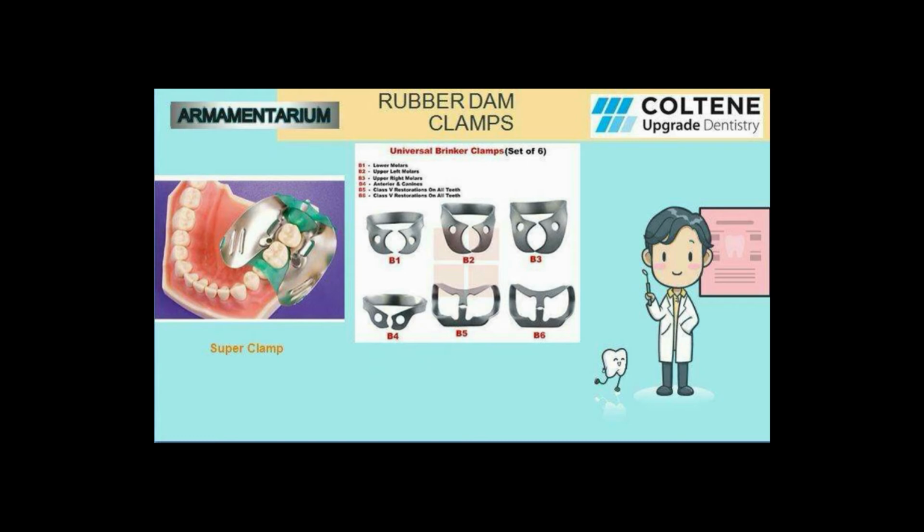The next one are the Brinker clamps. A set of 6 Brinker clamps are available in the market from B1 to B6.